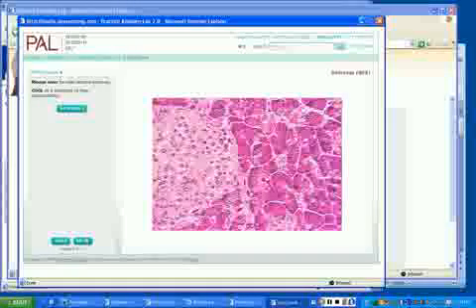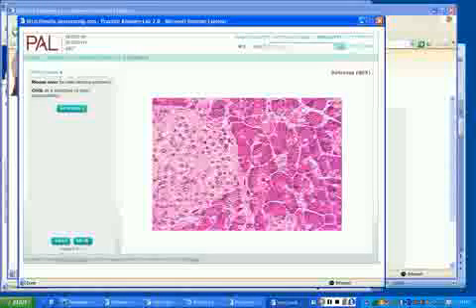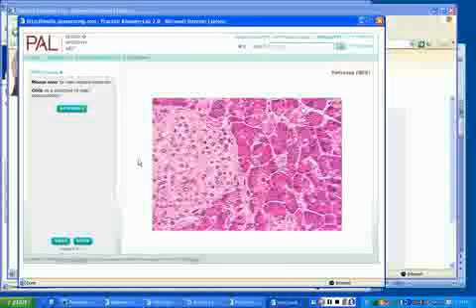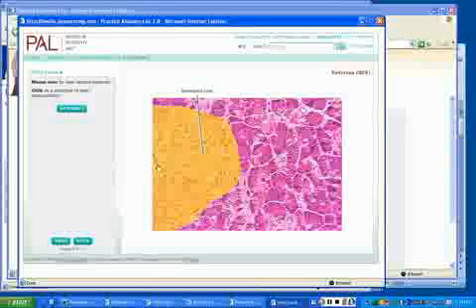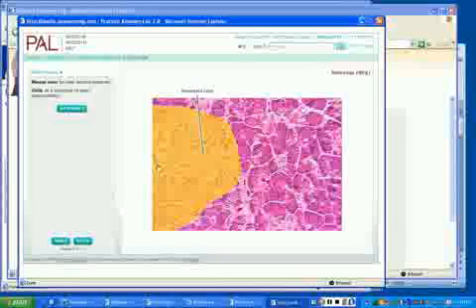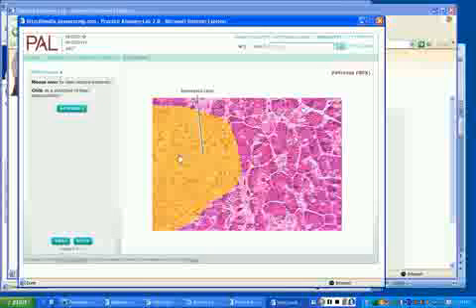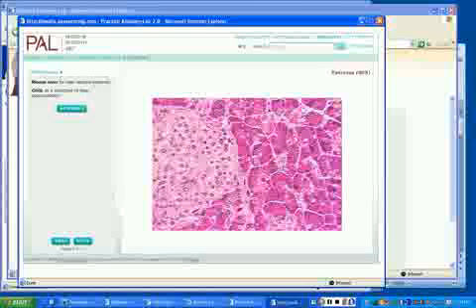Next slide. I'm just going to go in order that they have them here. Right, that's a pancreas. That's a pancreas. And a pancreas has this big thing called? Right, watch this. Boop. So cool, isn't it? Islet of Langerhans. That is the endocrine portion of the pancreas, the islet of Langerhans. What is this tissue, all of this out here?